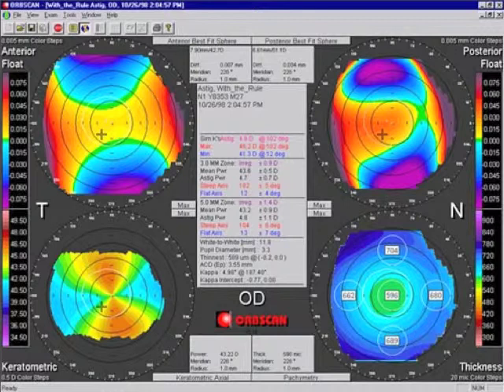We see the same sort of cylinder shape translated to the posterior cornea in the map in the upper right-hand corner. Once more, it's our beloved can of Schweppes bitter lemon, once more at about axis 10. The difference between the upper left-hand map, the anterior cornea, and the upper right-hand map, the posterior cornea, is shown in the lower right-hand corner map. The anterior cornea minus the posterior cornea equals corneal thickness. So this is a map of optically derived pachymetry of the cornea.